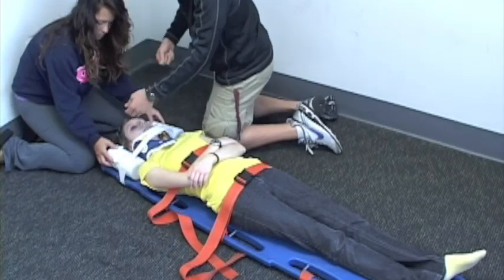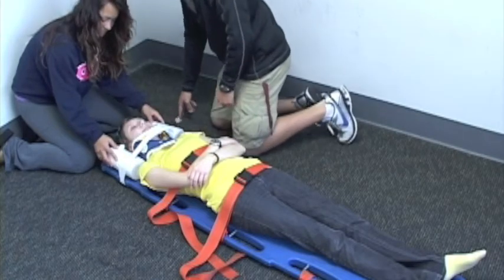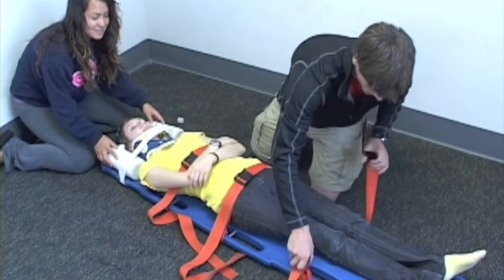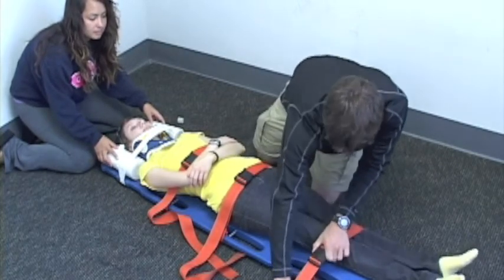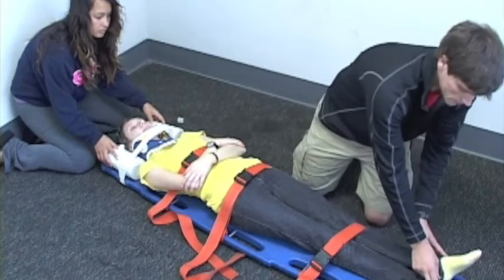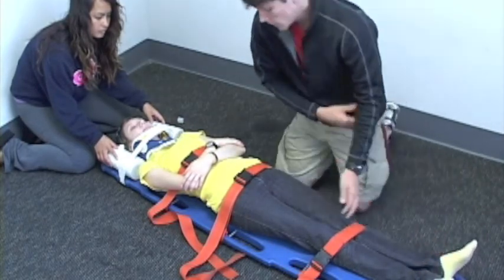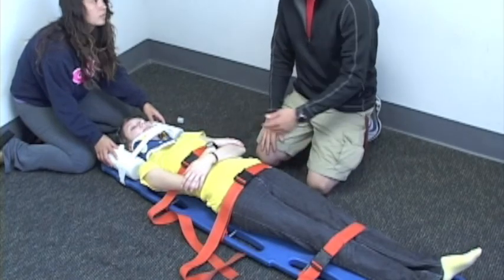If I had enough tape, I'd go ahead and pull it across and put it down — I'd fold it across her forehead. This is just a test. I'm going to secure my patient's seat. I'm going to go ahead and reassess PMS and then get a pulse. Push down, pull it nice and gentle. I've got my PMS. I'm going to pad any void space with my patient.